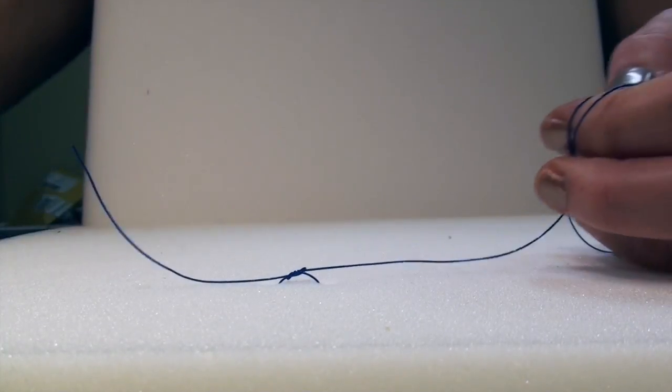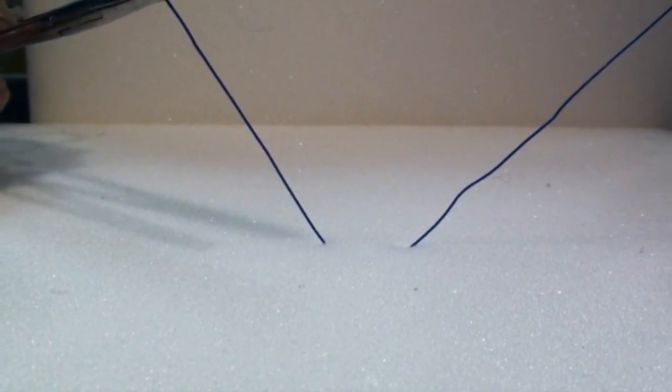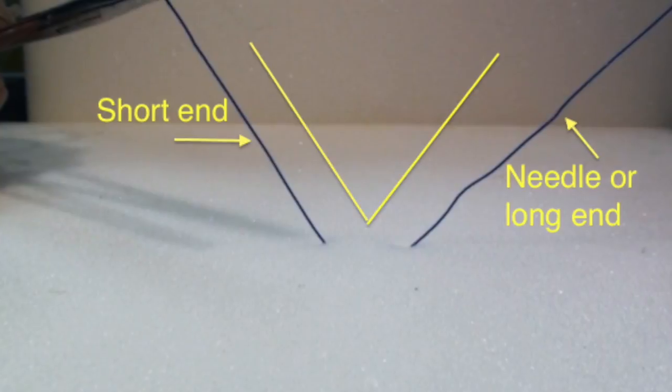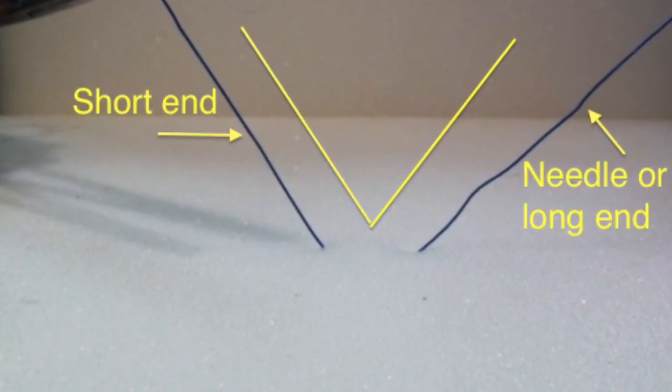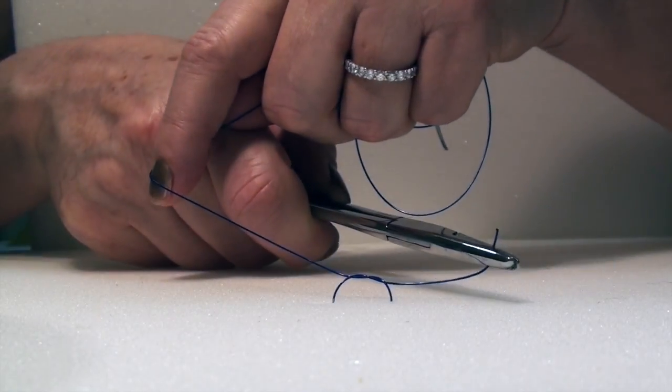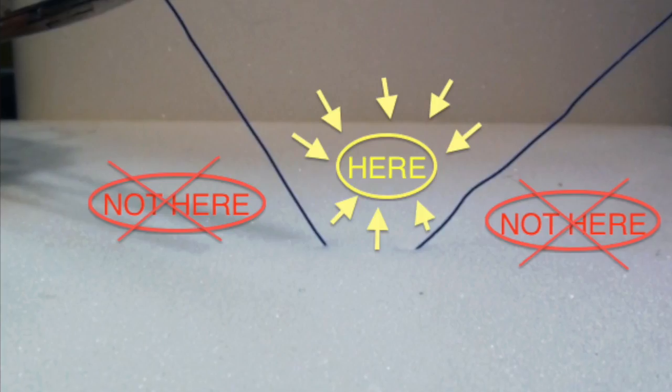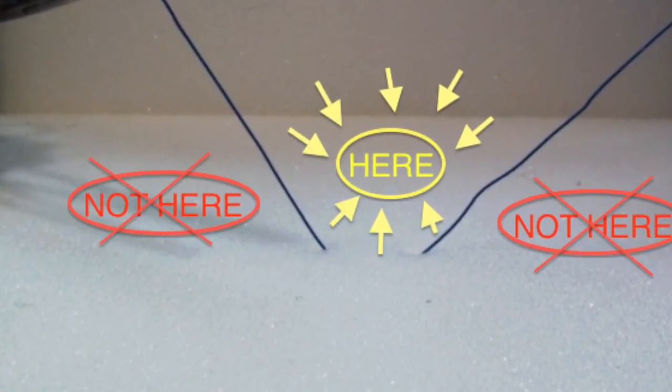The starting point with creating any good knot is where to place your needle driver. The short and long ends of your suture material create a V. Your needle driver always goes in the center of the V when creating a throw, always between your short and long end. Never start with your needle driver on the outside of either ends.